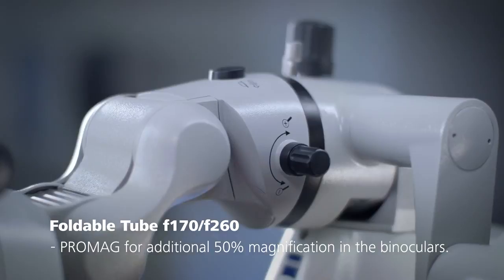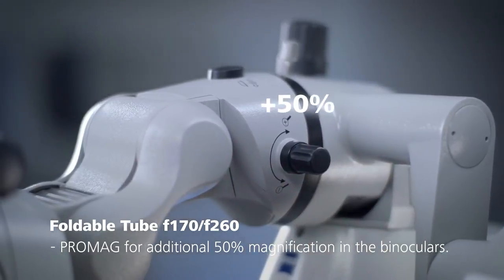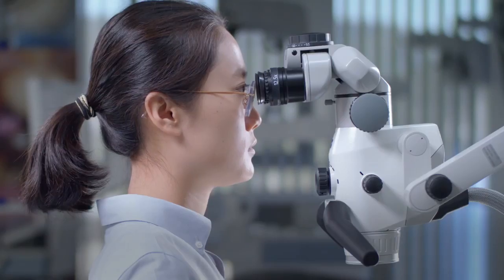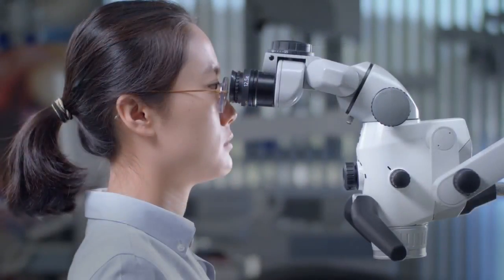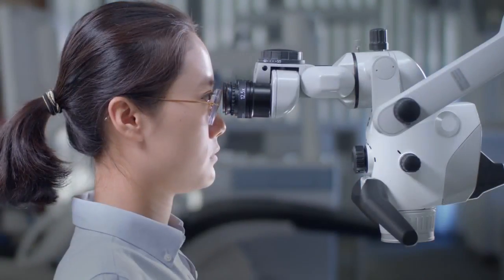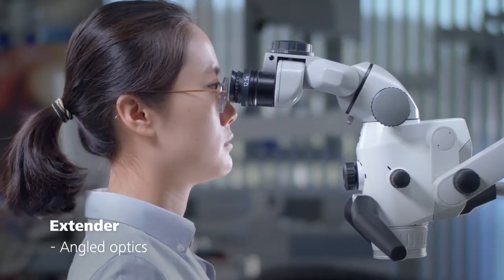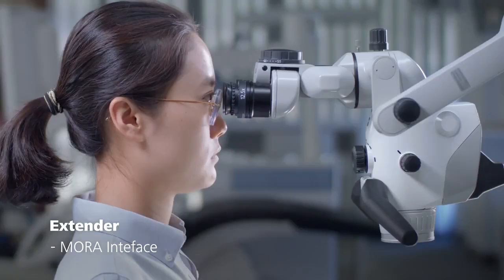The integrated ProMag function provides an additional 50% magnification in the binoculars. There are times when you might need additional space between yourself and the microscope. That's why Zeiss offers three kinds of extenders: a beam splitter, angled optics and a Mora interface.